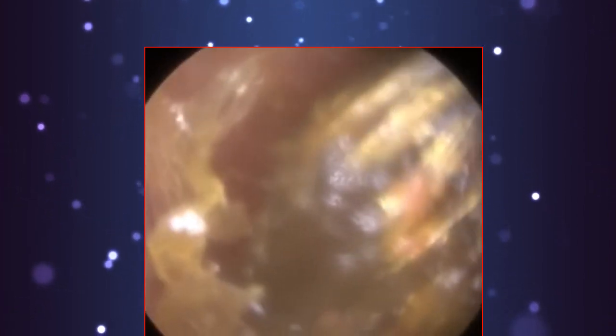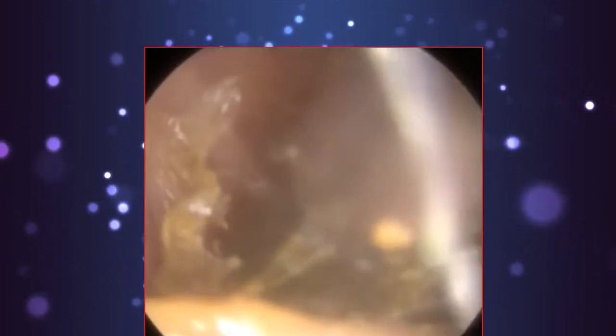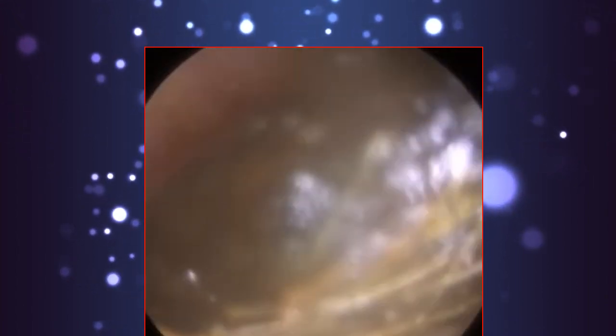Once we remove the more lateral wax, and this is the same for both ears, you'll see that the earwax almost is like chewing gum, stuck, impacted right up against the eardrum. You can see this consistency. It's very wet and stodgy. And just manipulating this forwards, wriggling it out. You can see all the hairs. You can see the colour. It's very dark, so it's oxidised. It's been there for a while.